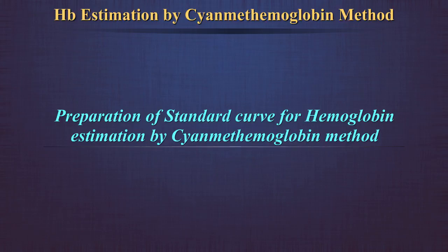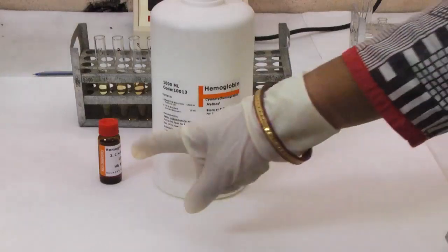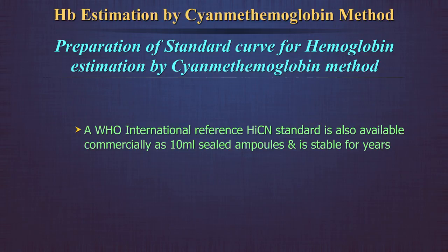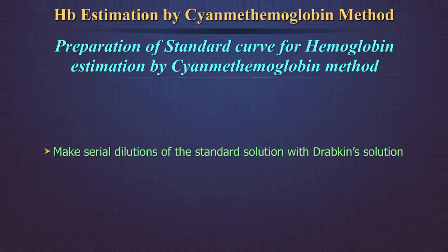Preparation of standard curve for hemoglobin estimation by cyanmethemoglobin method: In a laboratory where several samples are tested in a day, this is an important exercise to standardize the test method. You will require Drabkin's solution and a hemoglobin standard. The concentration of the standard used in this demonstration is 14.8 gram percent. A WHO International Reference cyanmethemoglobin standard is also available commercially as 10 ml sealed ampoules and is stable for years. Make several dilutions of the standard solution with Drabkin's solution.